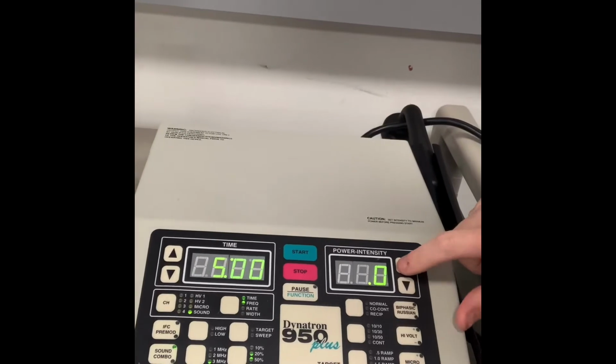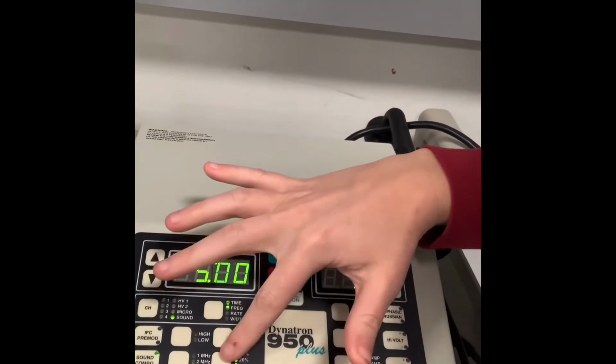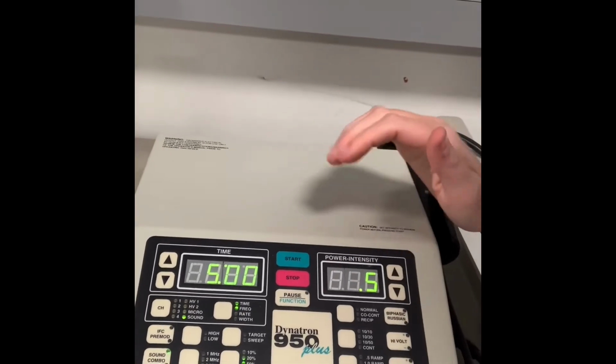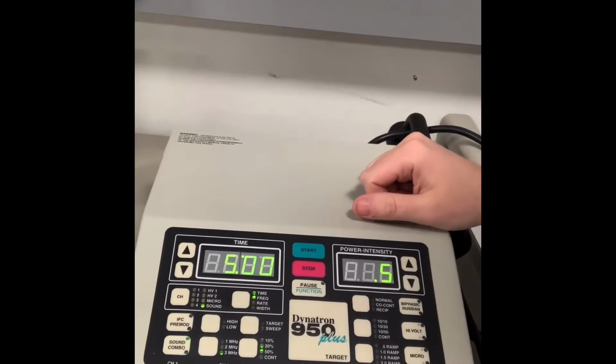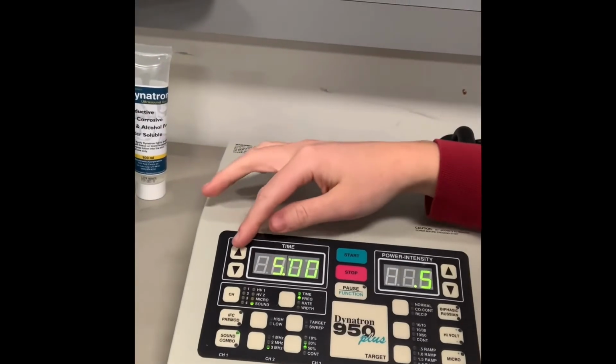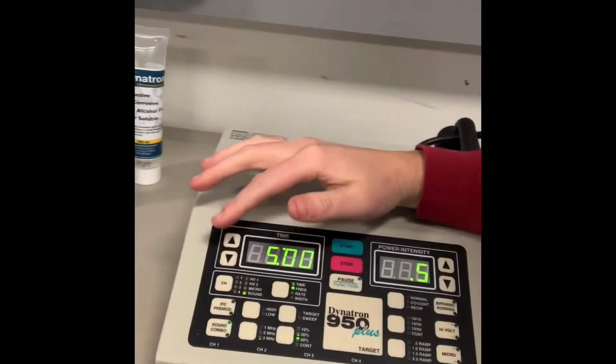And then for our intensity with these settings over here, we would do 0.5 to 1. So I'm going to start at 0.5 since he has never used ultrasound before. And then our time would be about 5 to 10 minutes. So we're going to leave it at 5.